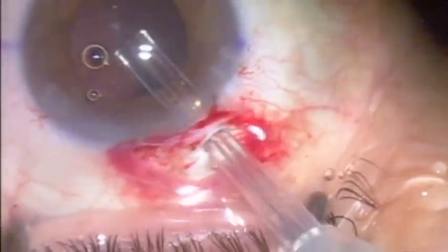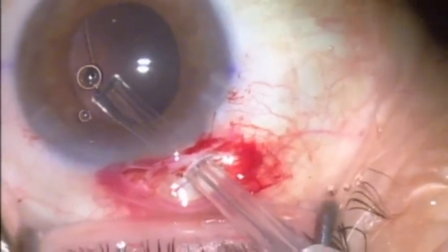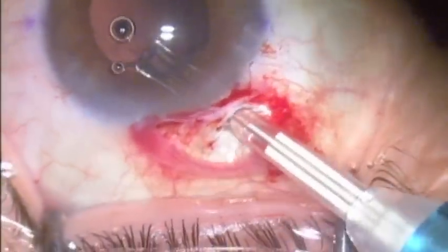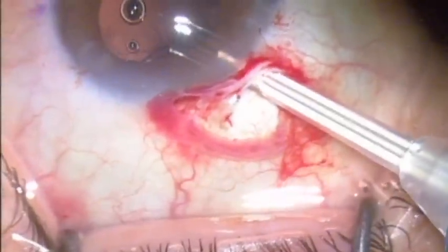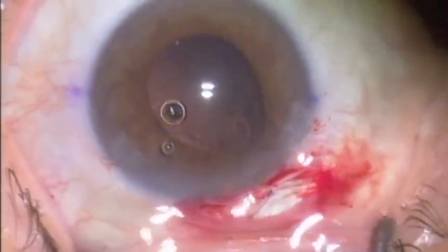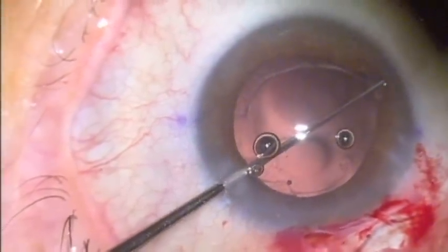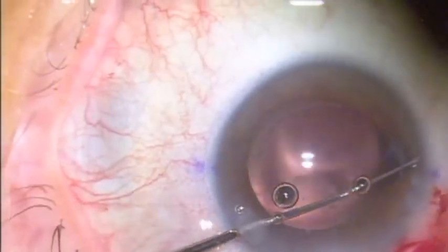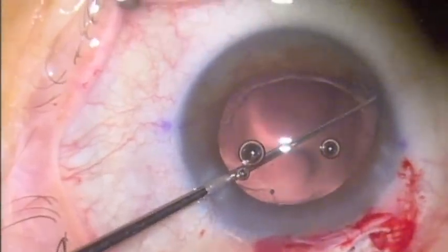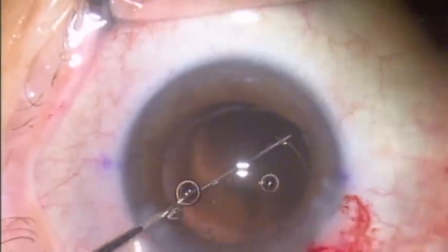In this case, the CTR is a bit difficult to insert because the fibrosis at the area where the plate was adherent nasally won't allow the CTR to advance smoothly through that area, which creates a little buckling pressure on the CTR as it's inserted. I had to drop that distal part of the CTR in the eye and it did not end up completely in the bag.